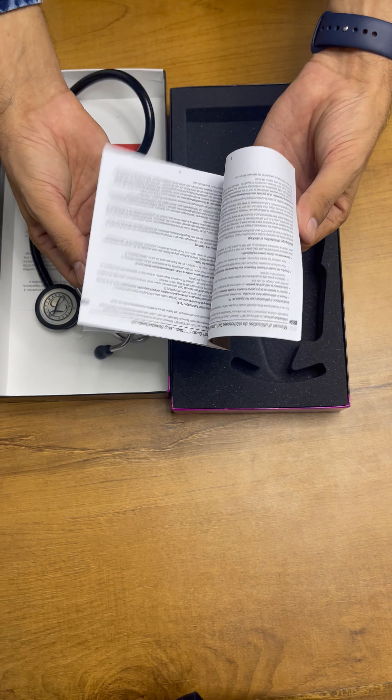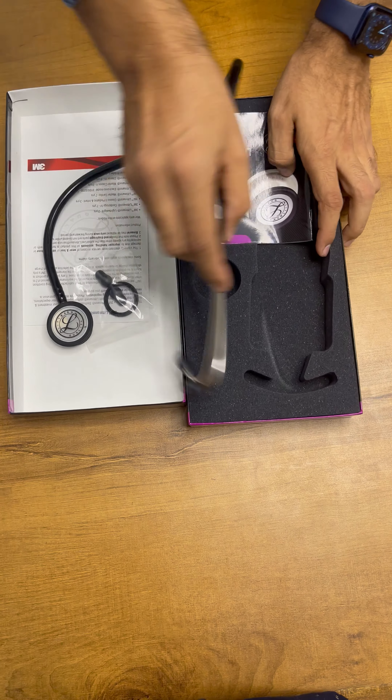This is the user manual given by the company. The device is good. Thank you.